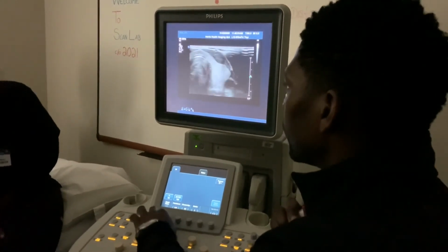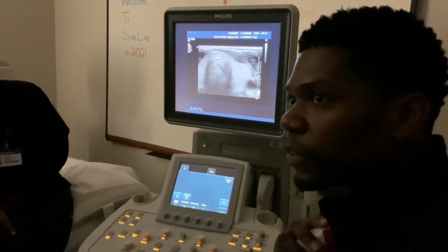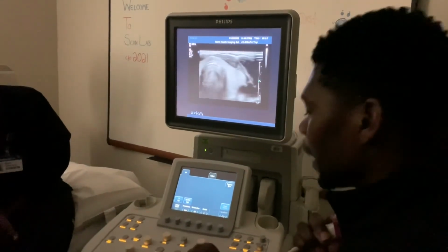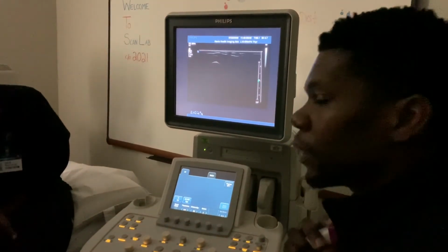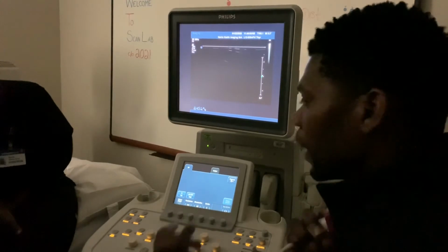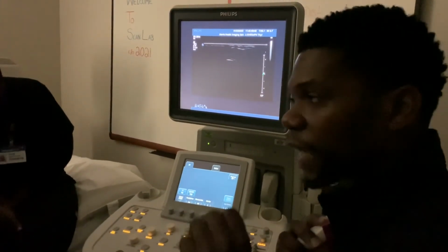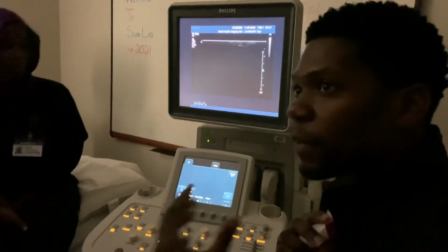now you can see it is at 100%. But doesn't that look just like this? Yes, it looks just like this. The only difference is, well, there are two differences. Output power functions during transmission. It is actually changing the strength of the sound coming to me.